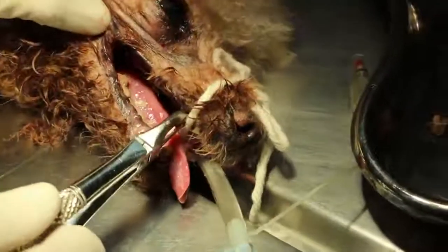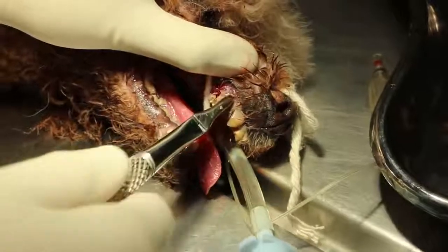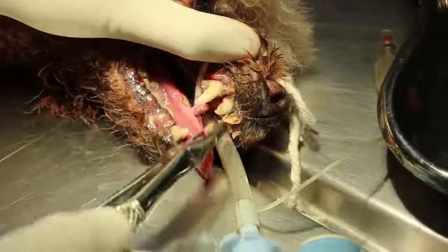Now we go to the canine. Take off the string, loosen the string. There's the canine. Canine seems to be okay.